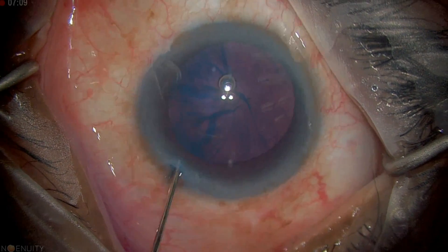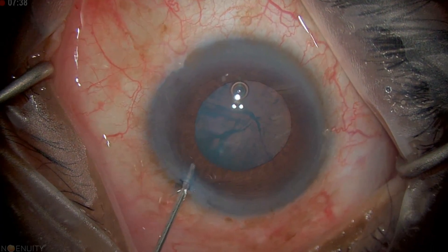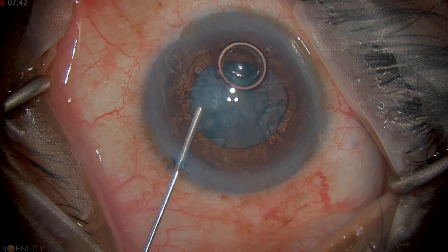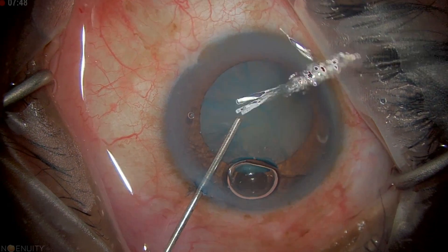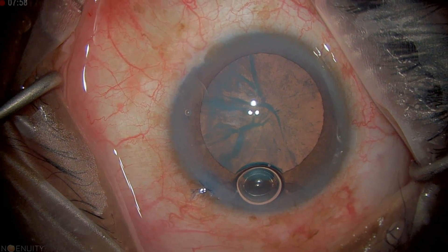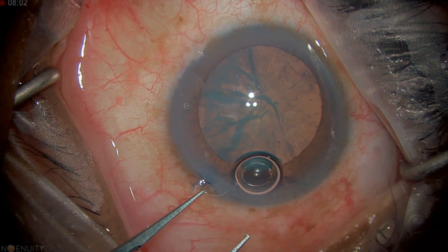I'm going to prime my viscoelastic — I'm using Viscoat here — and this is going to give us viscodilation and open the chamber. If there's an air bubble I try to get beyond it and either express it to the side port or around where my main wound is going to be. I tend to fill the chamber tight and then grab onto my side port for control.